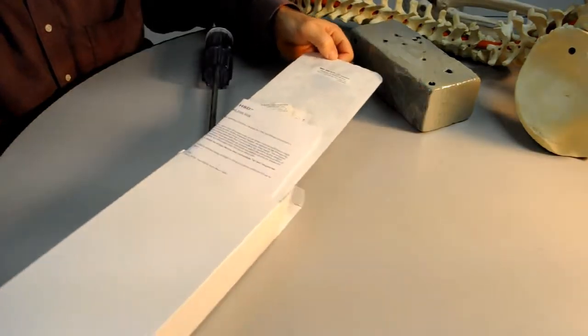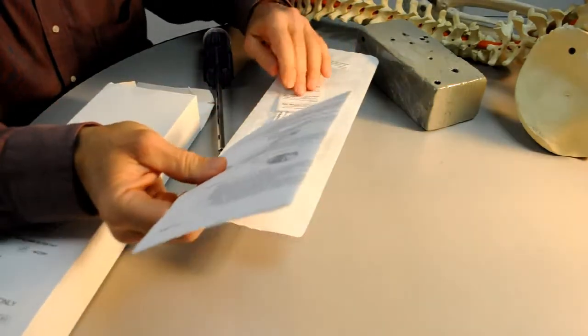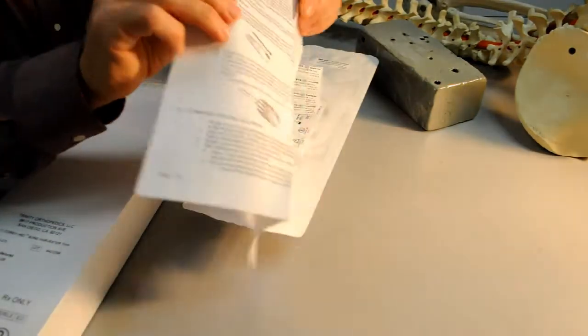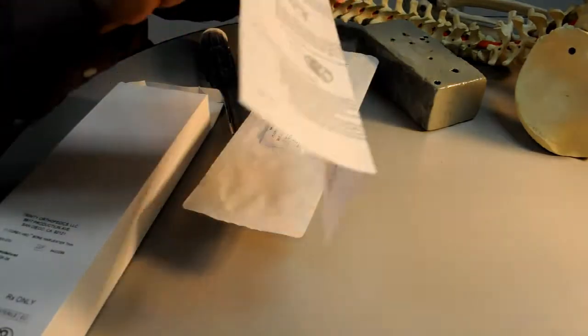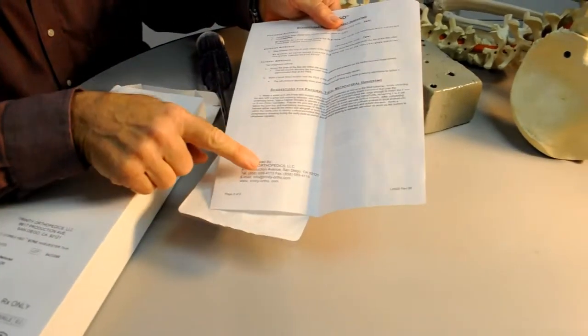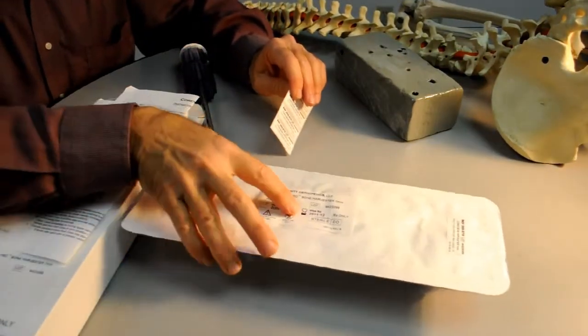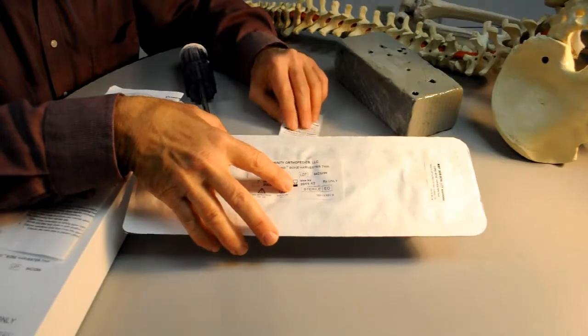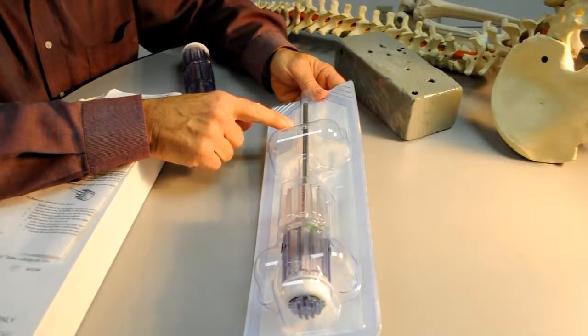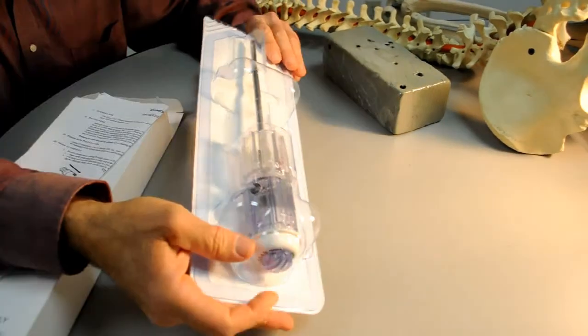When the box is opened, there will be detailed instructions for use which are reasonably thorough in describing the use of the device including recommended sites for autologous bone harvesting. The expiration date is also listed on the peel pack. The device comes in seven and nine millimeter diameters.